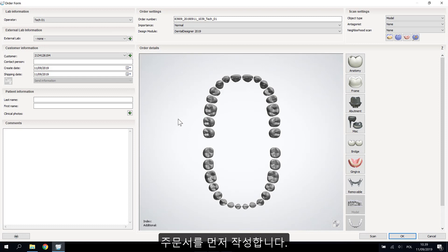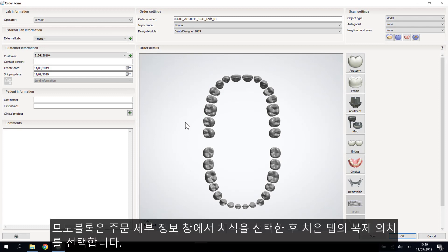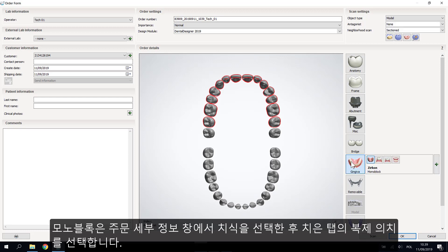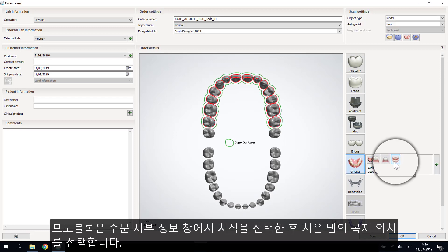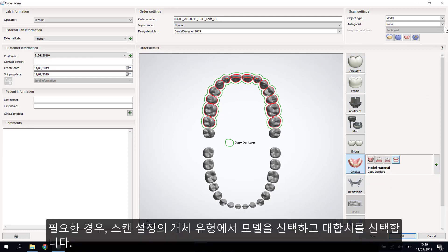Start by creating an order form for the monoblock. Select the artificial teeth in the order details window, then click on the Gingiva tab and choose the 'Copy Denture' button. After that, choose the model object in the scan settings and the antagonist if needed.